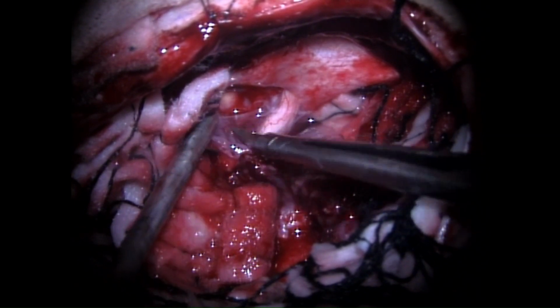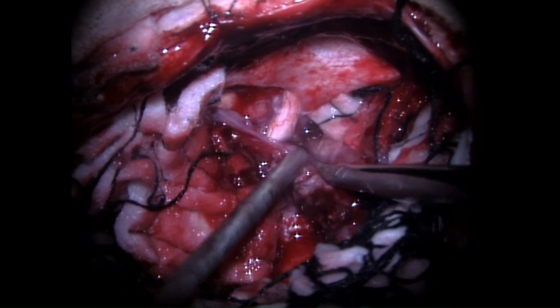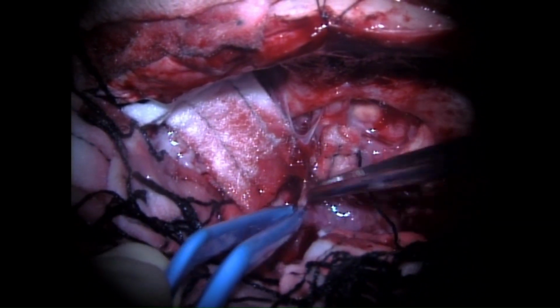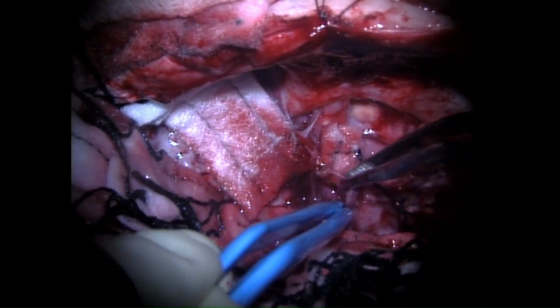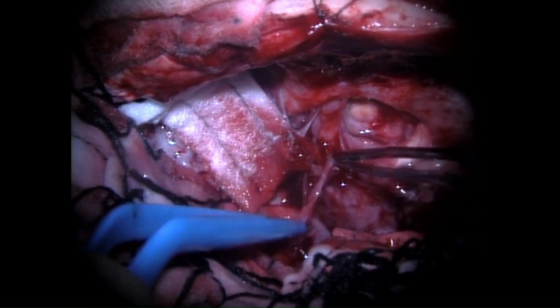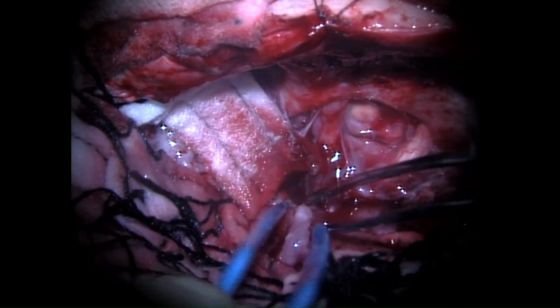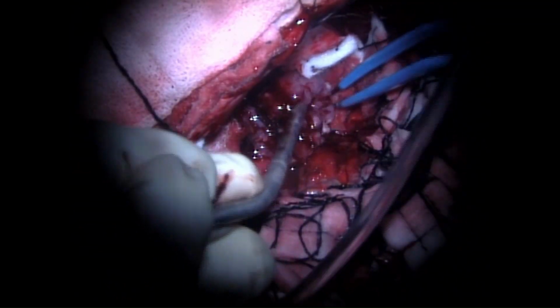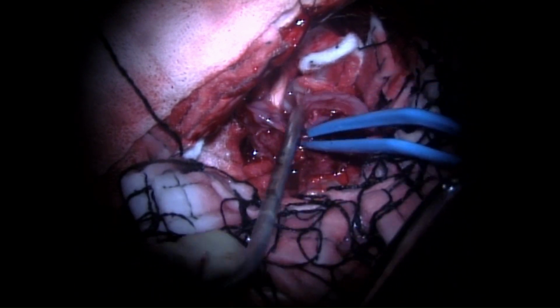The tumor is gently pulled off its attachment via the arachnoid membrane to the optic nerves bilaterally and the optic chiasm. Here you can see I'm using bipolar coagulation forceps in my left hand and using it to shred the tumor into smaller pieces and remove it, which of course is best for safety purposes.